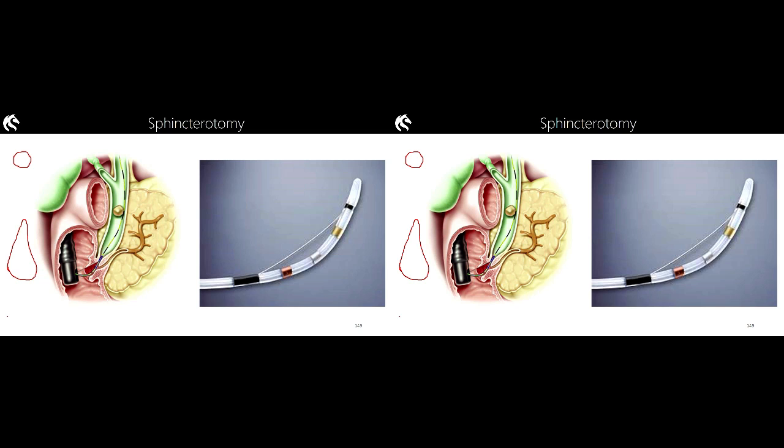Now, let's modify our catheter a little touch. We're going to take our catheter, and instead of it just being a hollow tube, we're going to attach a tiny little wire onto the outside of the tube in 2 points. That wire is going to be fed all the way back to the gastroenterologist.